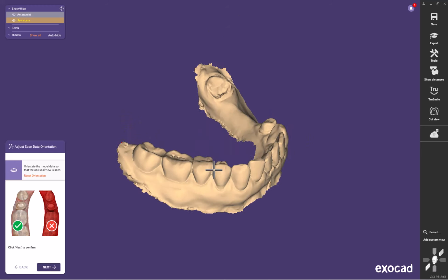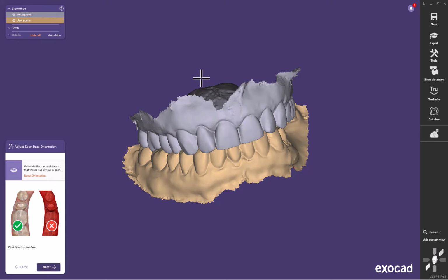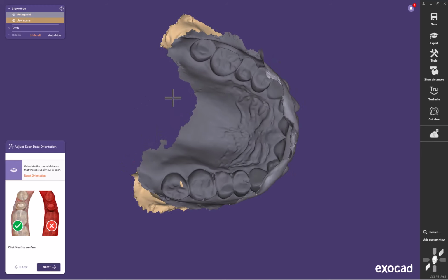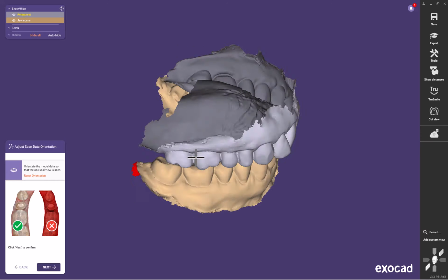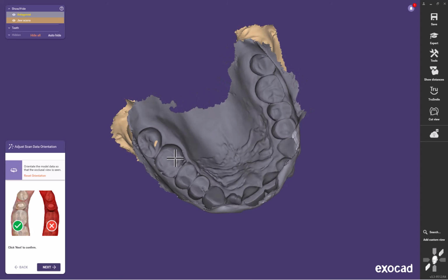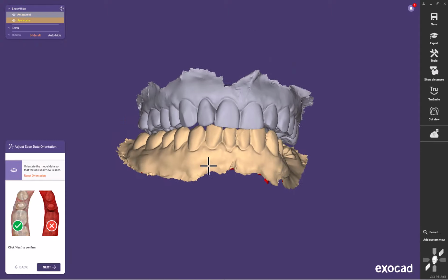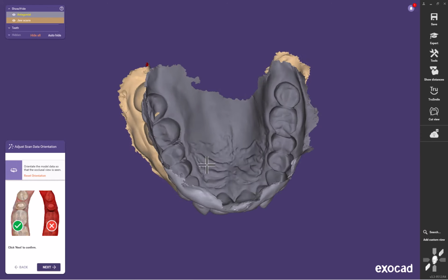Now, quite frankly, her muscles are relaxed enough that she hinges very freely, and we were able to reproduce centric relation quite comfortably. So we captured these models using a leaf gauge between the front teeth, and we keep removing leaves until the patient feels the point of first contact, and then we remove one, put one back in until we establish exactly where that first point of contact is. Then at the lightest point of contact with the minimum number of leaves in, which gives us very, very light contact, we capture this bite registration.